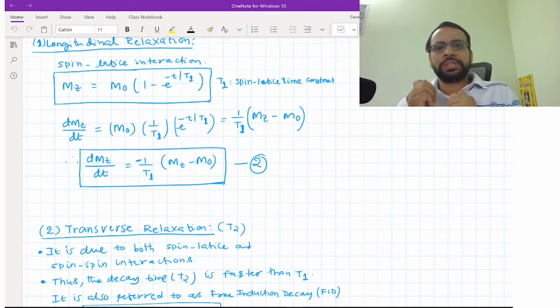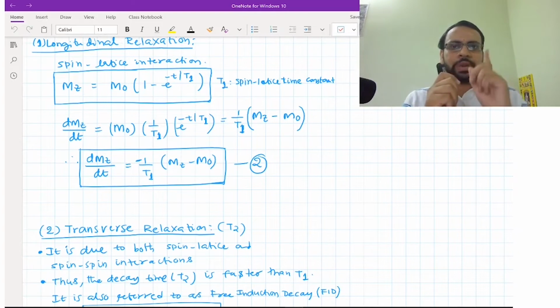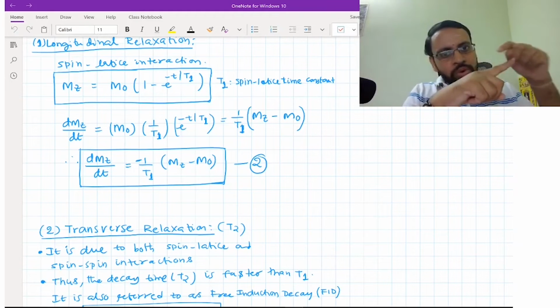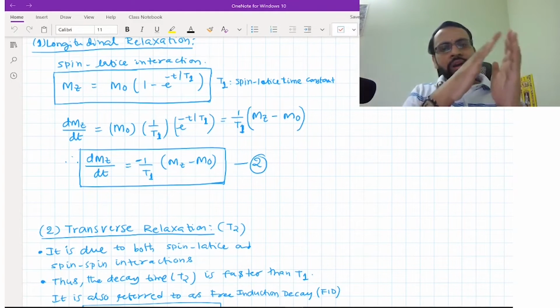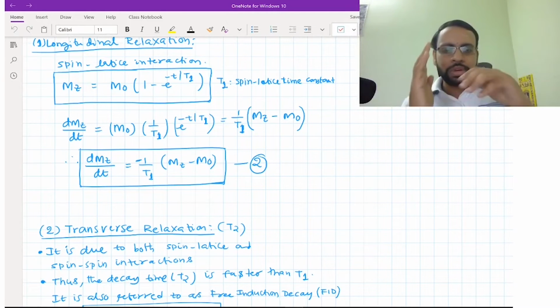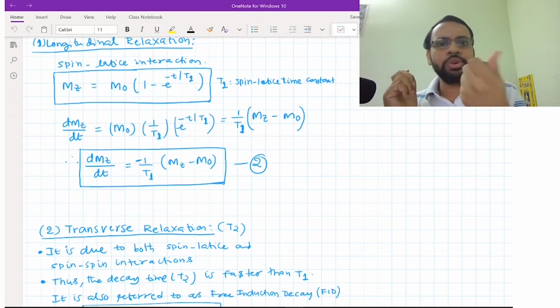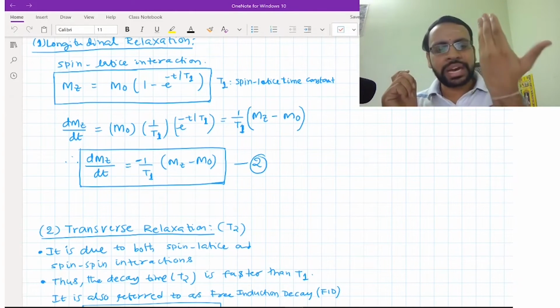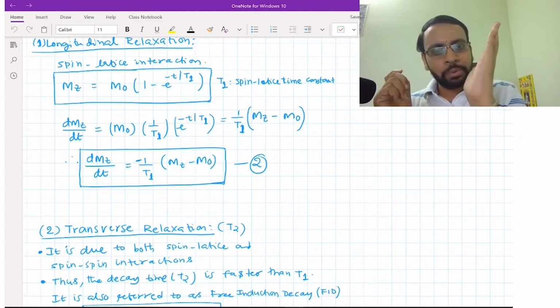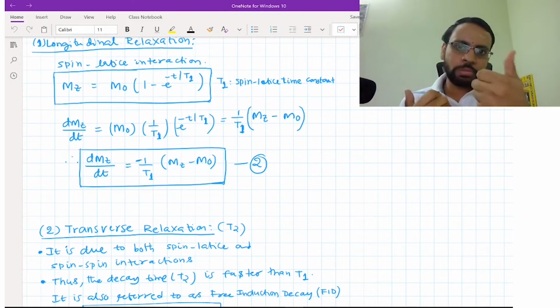You could think of it in this manner. You come back to the quantum physics, where each dipole is rotating in its own axis, right? Now all of them are rotating either parallel or anti-parallel. That has happened. But in addition to that, what could happen is that the phase, the starting points for each of those spins, despite the same alignments, could be different.